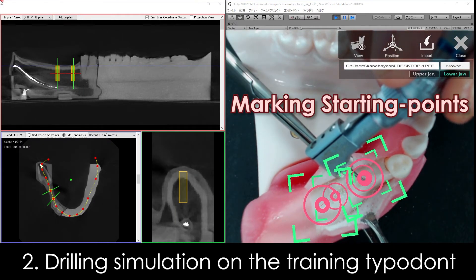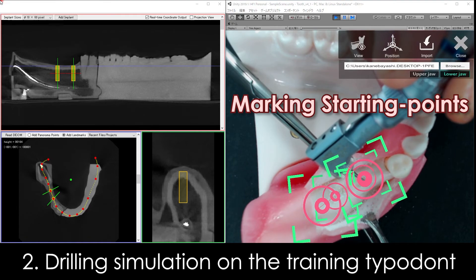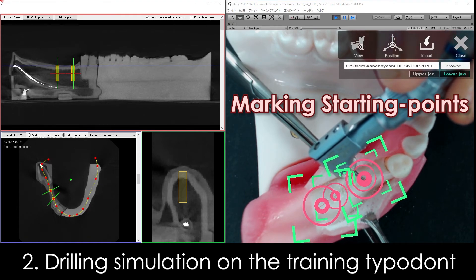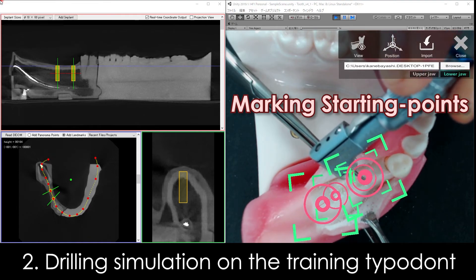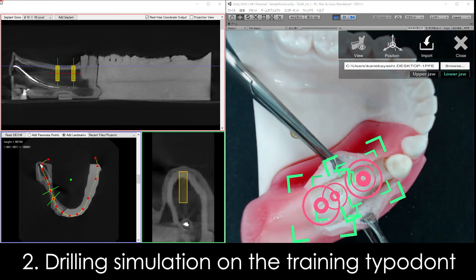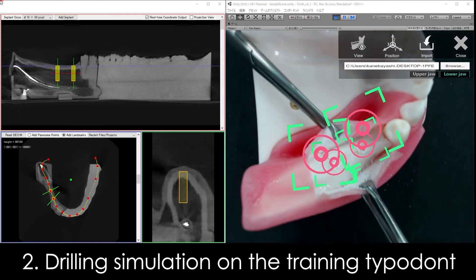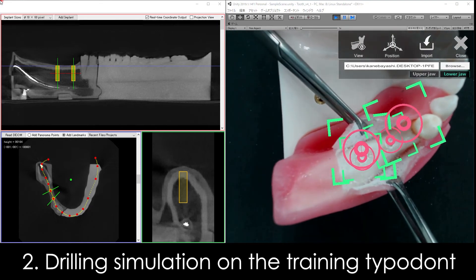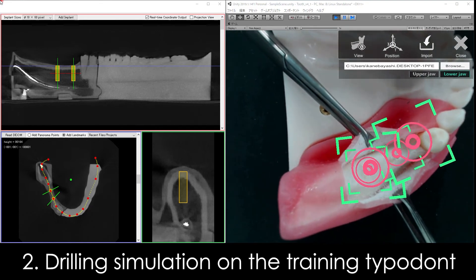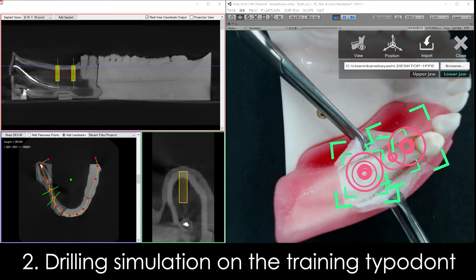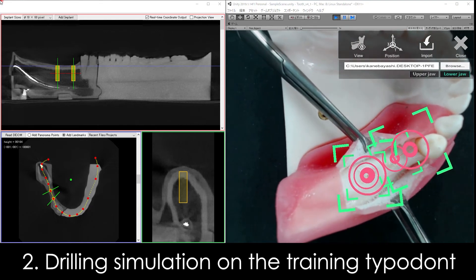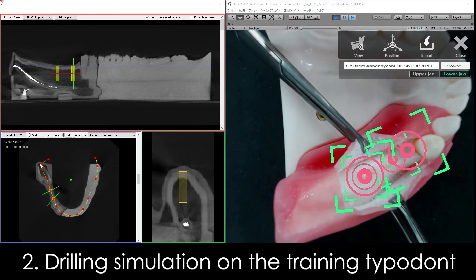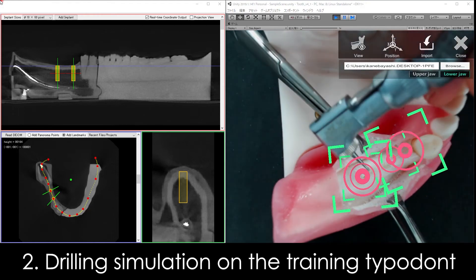Next, mark the starting points on the bone surface with a round burr.